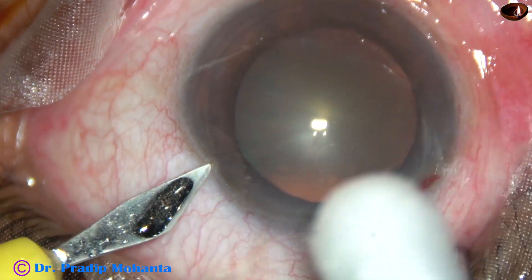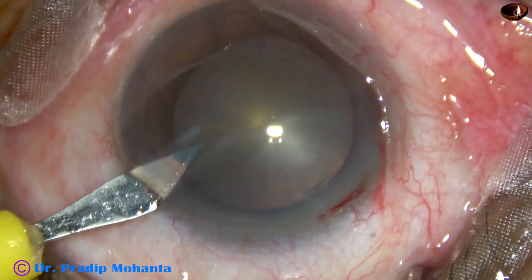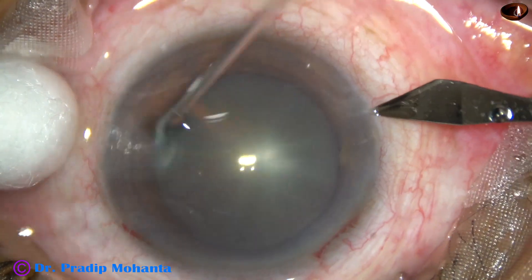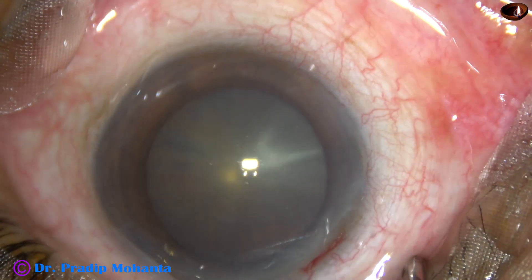This is a side port on the left side of the main incision, about 3 clock hours away. One more side port is made on the right side of the main incision, the same distance away, with a lance tip knife.